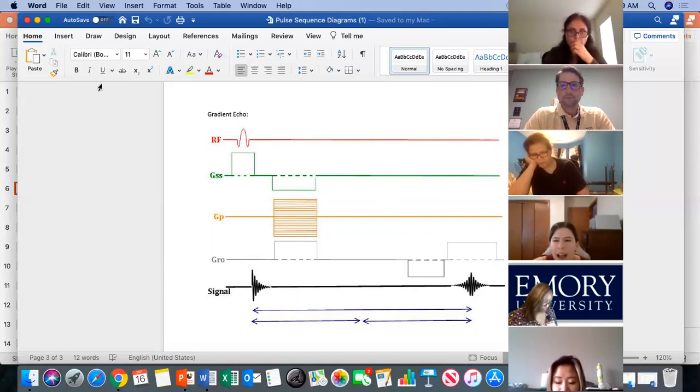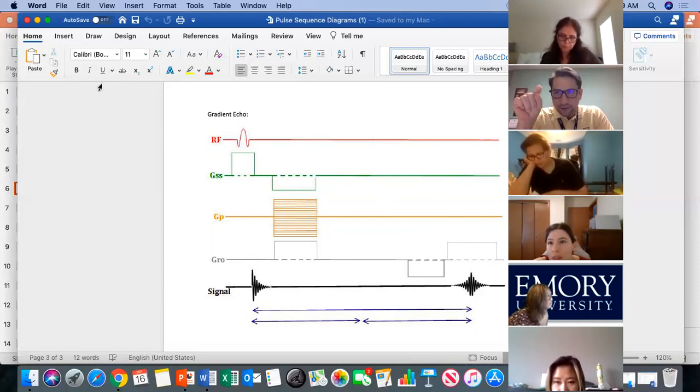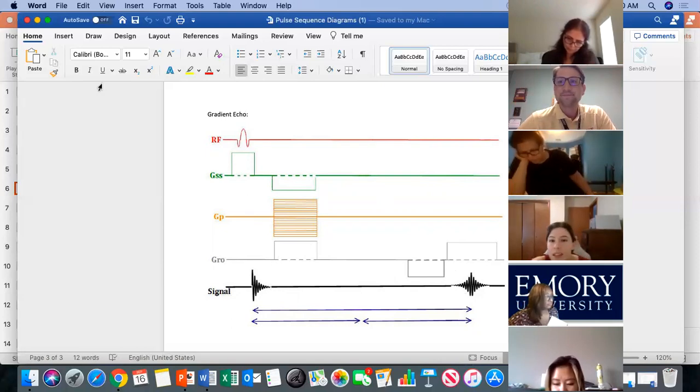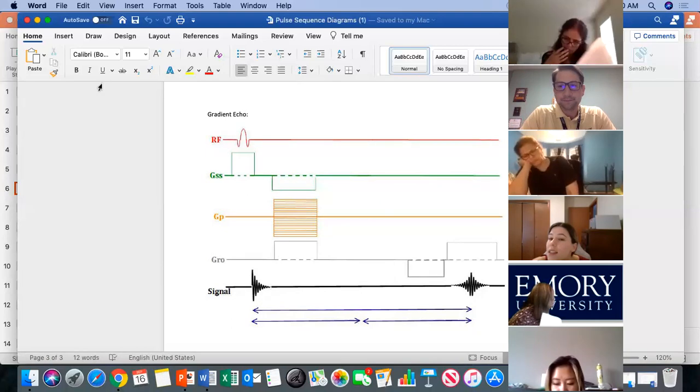Did you say alpha variable flip angle? Yeah. The alpha, the little fish symbol, is usually how they draw variable on tests and things like that. So the alpha symbol, it looks like a little fish. But that just means variable.